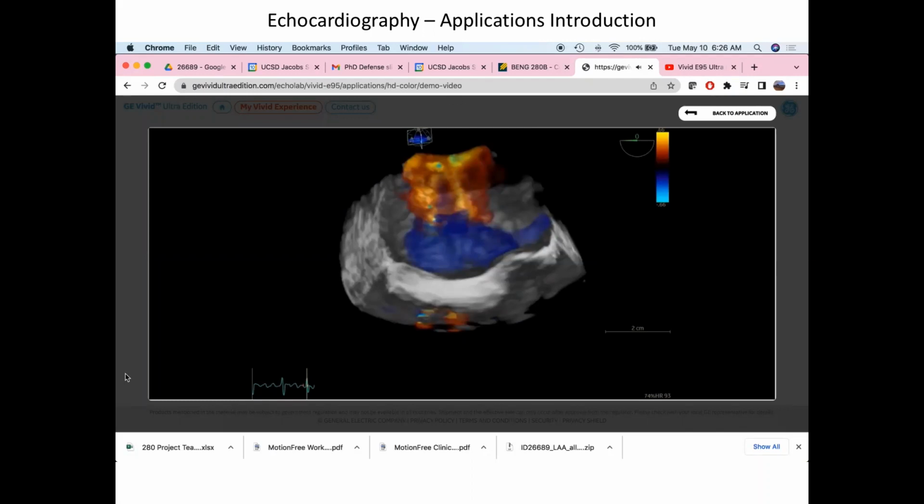Did we image one that's a really short R to R, or one that's a really long R to R, or one somewhere in the middle, right? And so we've actually run into problems where we've imaged one of these really short beats, and it's not a natural looking beat, right? It's just a little twitch, right? And so that is not representative of what's going on in that patient's heart. So do you go back and do it again? You know, there's that question.